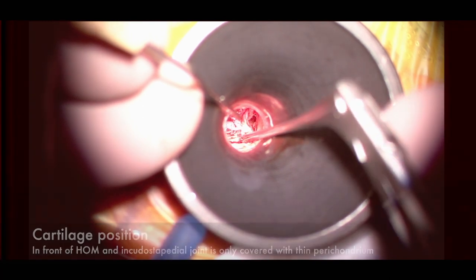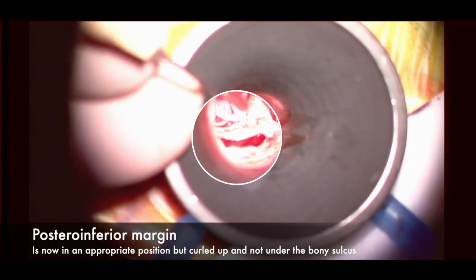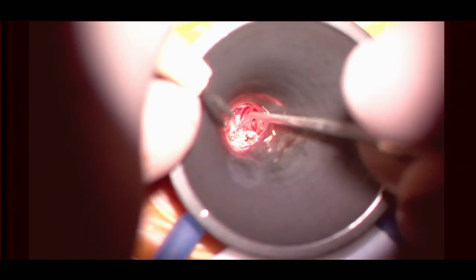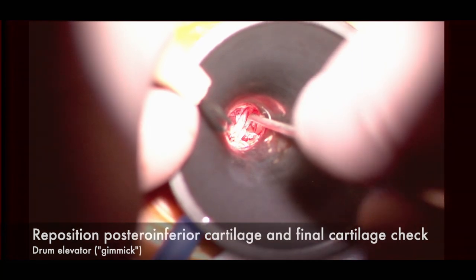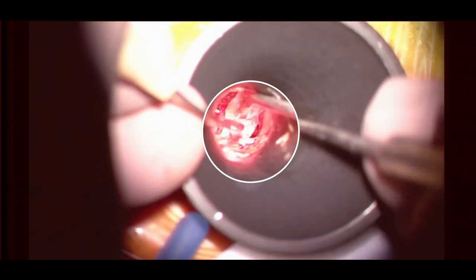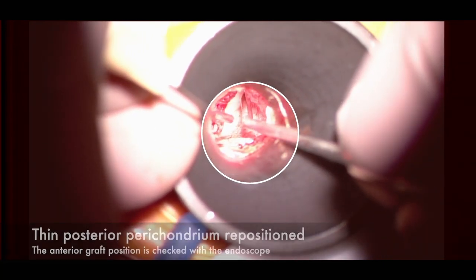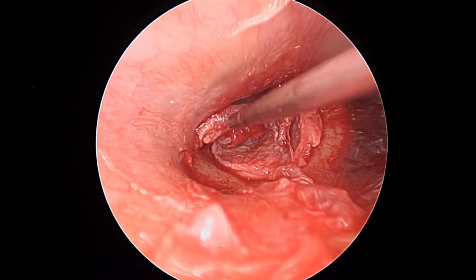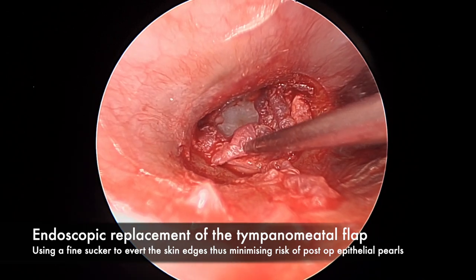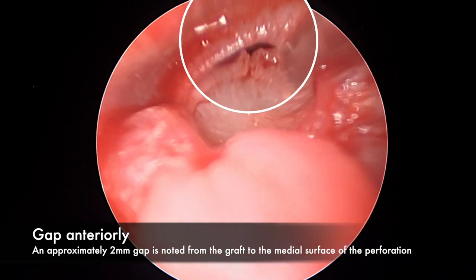The cartilage still seems to poke out a little — trying to place it down with a drum elevator. Relaying the thin perichondrium over the ossicles — it doesn't actually touch the ossicles because it's tented by the memory of the cartilage, sitting over the scutal bone. Pushing down with a drum elevator and double-checking position below the umbo. Switching to the endoscope to check the position of the anterior aspect of the graft, which can't be seen easily with the microscope. Using the sucker to replace the tympanomeatal flap and inspecting the anterior margin — there is a small gap of around 2 mm.